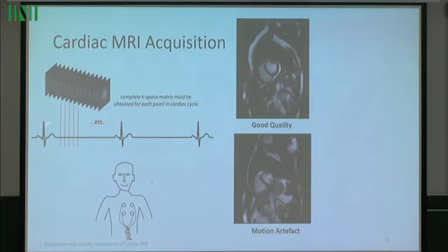the ECG signal. Portions of the k-space are acquired at different heartbeats, and thanks to the ECG information, they are fused to generate the full k-space of the patient. So basically the acquisition is done in k-space domain, frame by frame, and the ECG signal is used in order to guide the process to generate the full MR acquisitions.